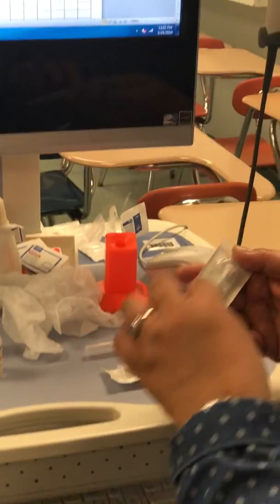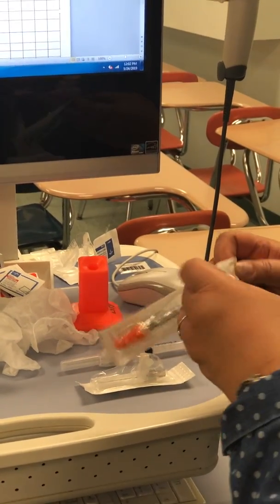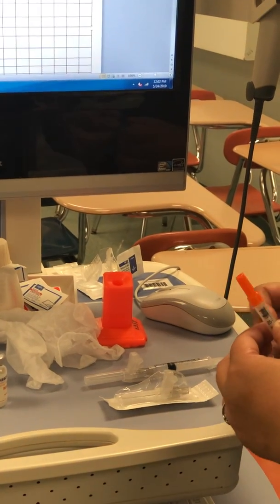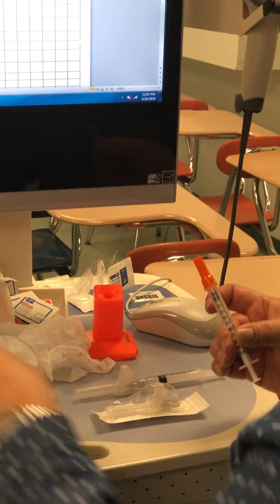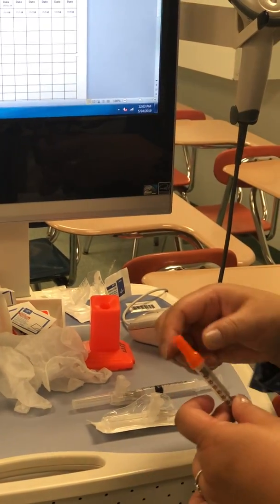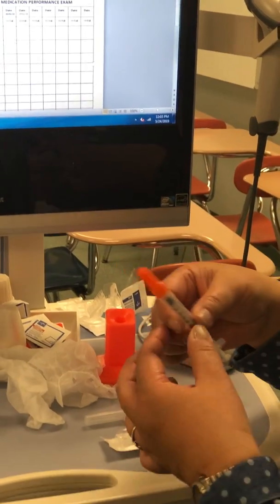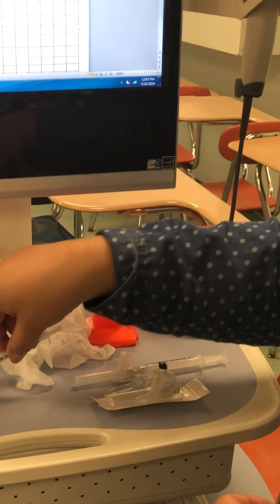This one is for our insulin, all right? So 400. Remember, our finger sticks is 400. There are two ways to do this. You can put the amount, let's say 15 units of insulin air, first in the NPH, and then get like 10 units of air for the regular insulin.